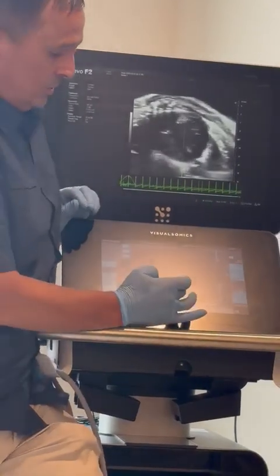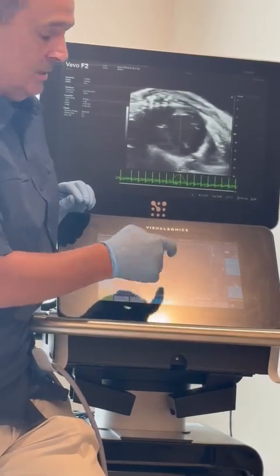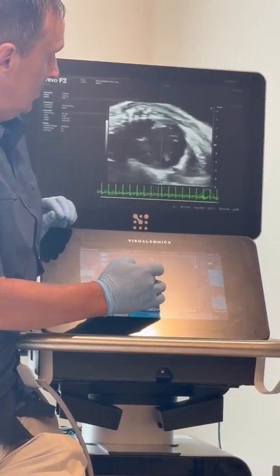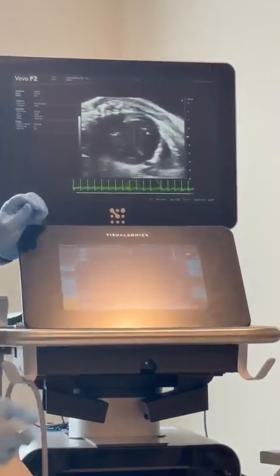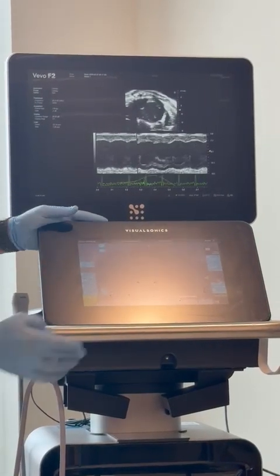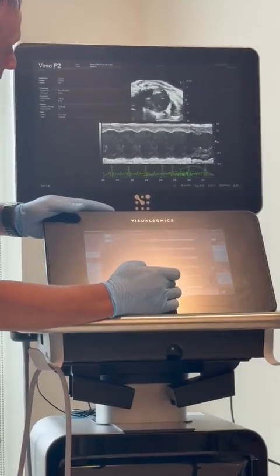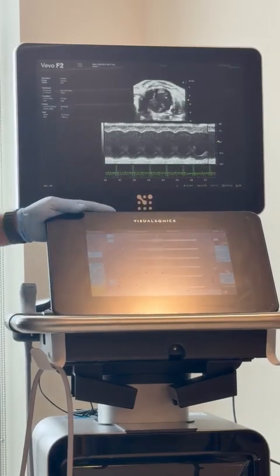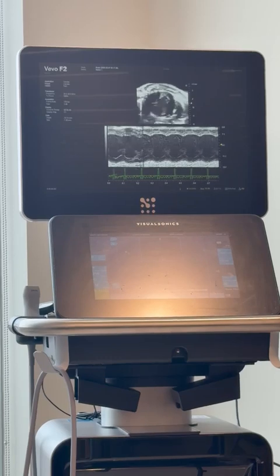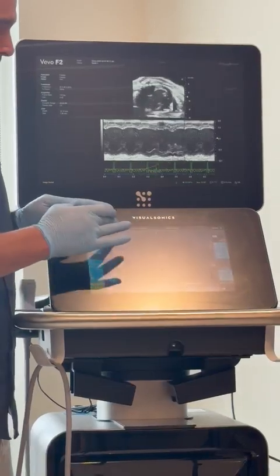We're going to go to M mode. We talked about motion mode. I'm just going to click on these balls outside these horizontal lines and drag it so that they're just outside the walls of the heart, and then hit start, and then we'll see your LV. So let me just make this a little bit brighter. So this is your anterior wall, or sorry, your posterior wall here and your anterior wall. So we can actually do an auto LV analysis on that, and from that it'll calculate LV mass. Okay, so we're going to save that.